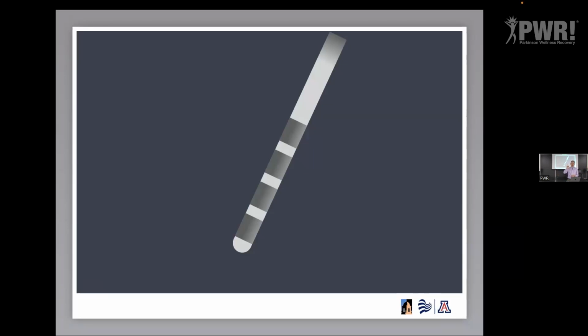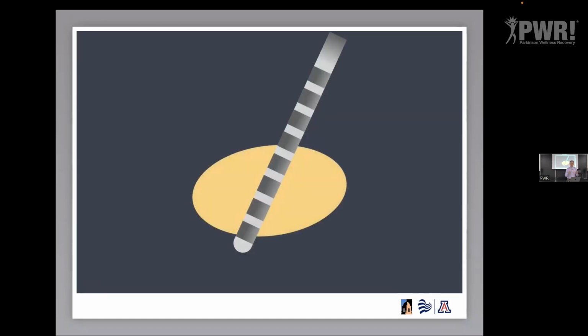You'll also notice there are four electrodes on the end of this little device we put in the head. We do that so that we can pick which ones we stimulate around. One way to give you more flexibility is to make more electrodes. This is an example of an electrode that came out on the market a couple of years ago. Instead of four little rings, it has eight smaller ones over a larger span. That allows you to individually control the amount of current, the red spheres around the electrode, so you can shape the current to maximize stimulation in this little orb that we're trying to stimulate. Let's say you put the electrode in a little deeper, just a millimeter or two deeper than usual.